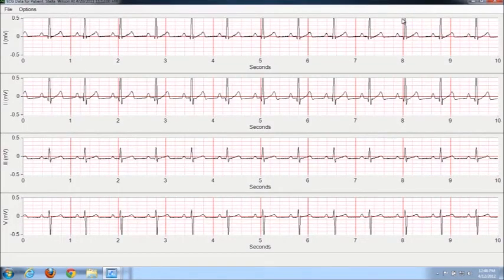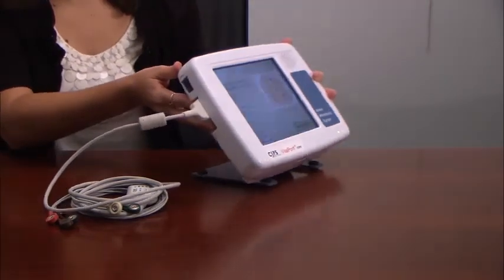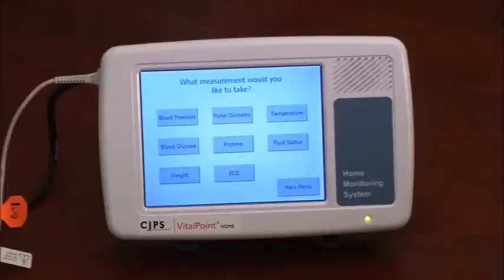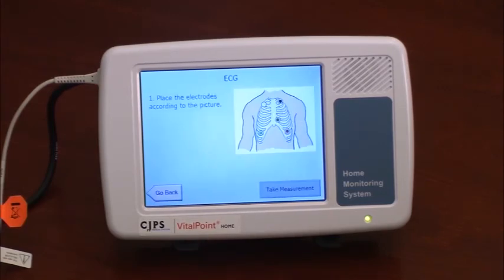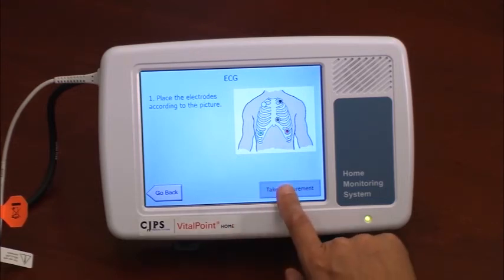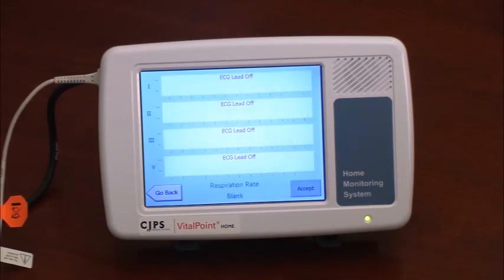Our electrocardiogram is a 5-lead ECG, which allows patients to easily place the leads in the proper location on their chest, thanks to color-coded and labeled electrodes and a clear diagram to ensure proper placement. The measurement has been shown to be easily performed by patients alone at home while providing very good data. The system is intelligent enough to detect if one or more of the leads are placed incorrectly and will provide the patient with an error message.